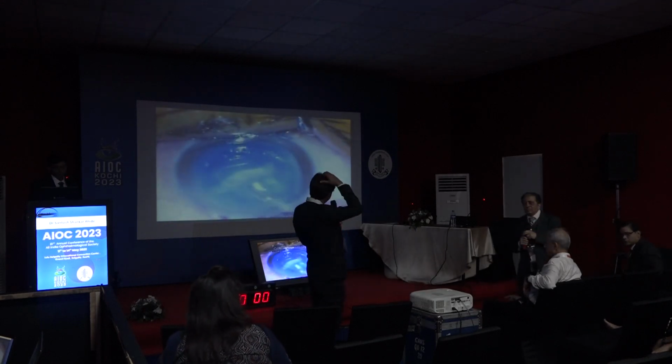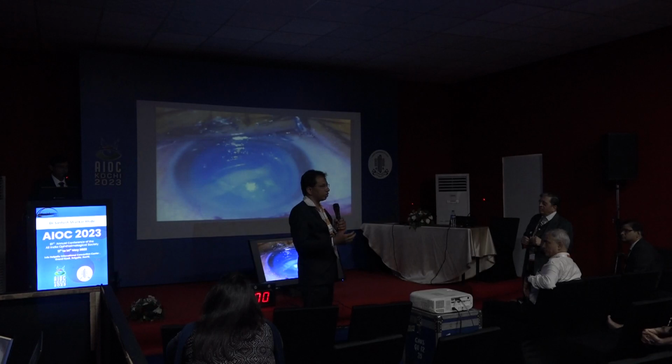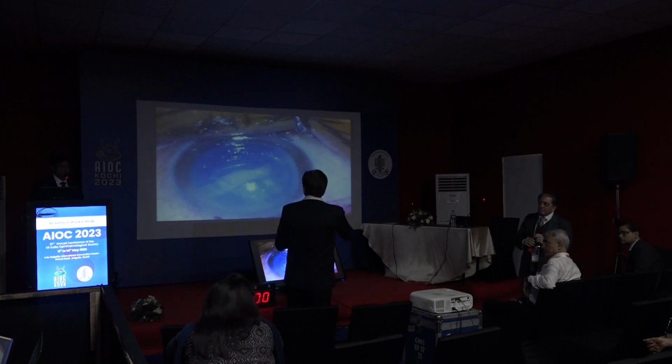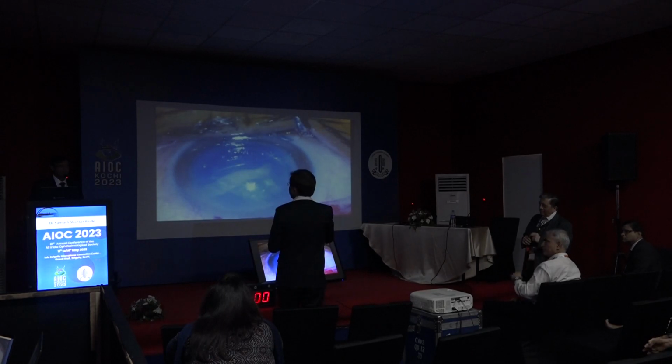Yes. And the one thing which I would like to say, sir, is decompression has to be done only when you have a small rexis. Now that all of us are doing two-stage rexis, the incidence of the rexis running away has reduced dramatically. You don't have enough time to puncture and come out and go for a forceps. By the time you do that, it goes on. So you first have to puncture and finish the rexis.